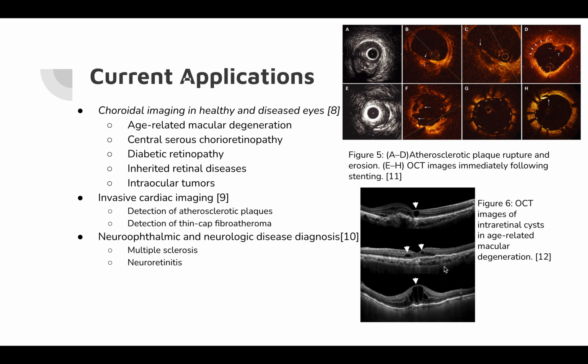Choroid is thought to be involved in the pathogenesis of retinal disease, but until the development of spectral domain OCT, it was not feasible to image this. Furthermore, longer wavelength OCT systems, including swept source technology, can help detect subtle microstructural changes in chorioretinal disease.